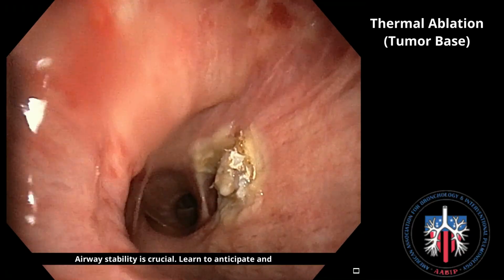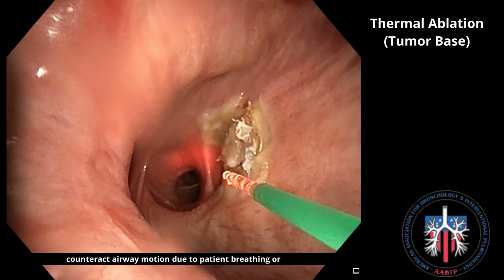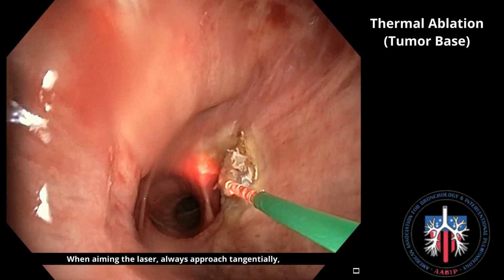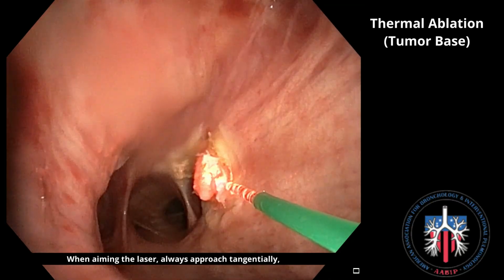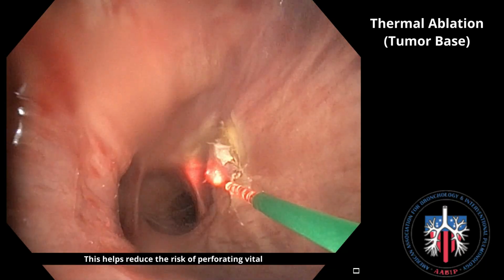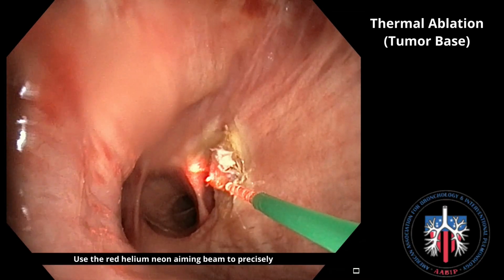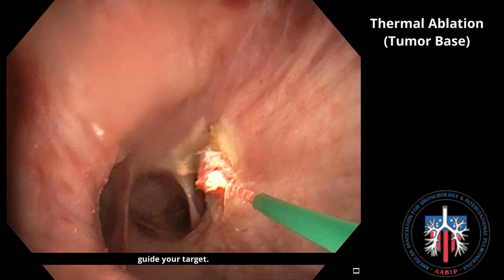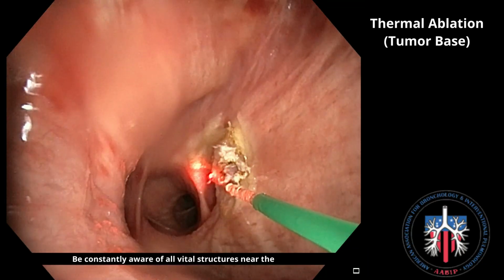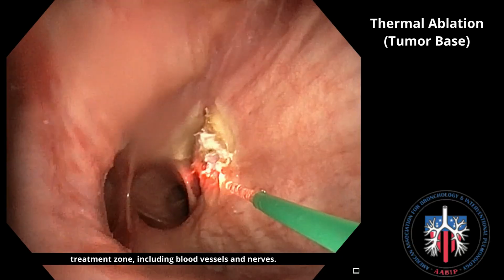Airway stability is crucial. Learn to anticipate and counteract airway motion due to patient breathing or equipment movement. When aiming the laser, always approach tangentially, not perpendicularly. This helps reduce the risk of perforating vital surrounding structures. Use the red helium neon aiming beam to precisely guide your target. Be constantly aware of all vital structures near the treatment zone, including blood vessels and nerves.